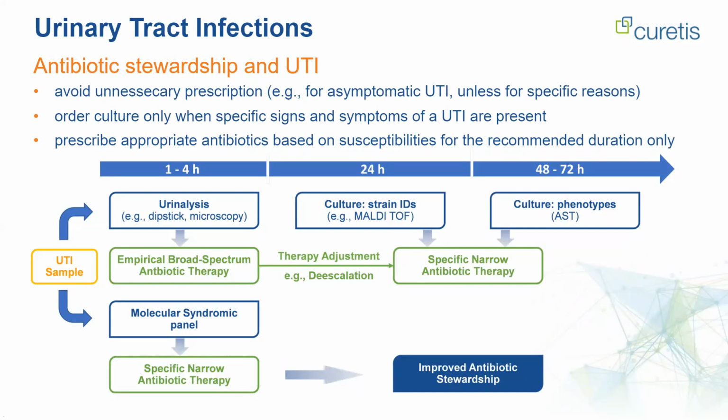So let's start here with this one. You have outlined the advantages of syndromic panels for UTI. Could you share what the potential limitations would be?